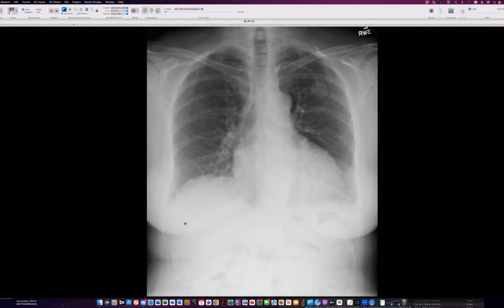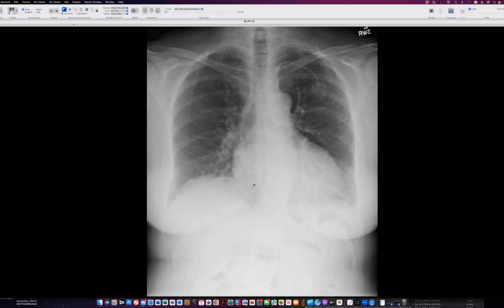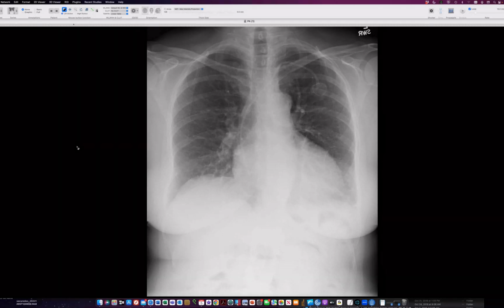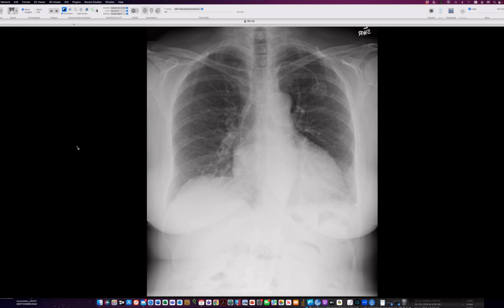Okay, I would like to show you this case of a woman who has a diagnosis of cardiac amyloidosis. She has a plasma cell abnormality that they detected in her bone marrow. She had a cardiac biopsy that showed amyloid, and she has a little bit of cardiomegaly here. At this point, she has a port catheter in place. And she has had a number of CT scans, many of which early on showed florid septal lung edema, and that edema finally resolved.